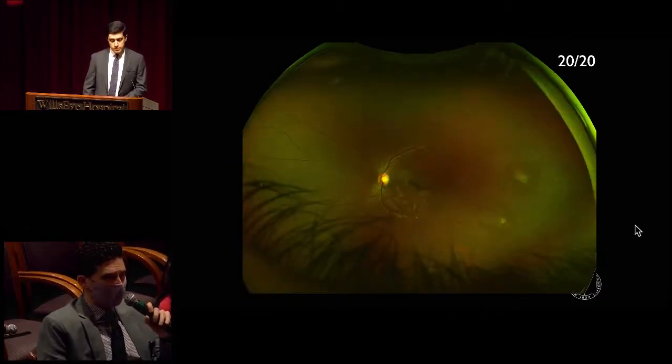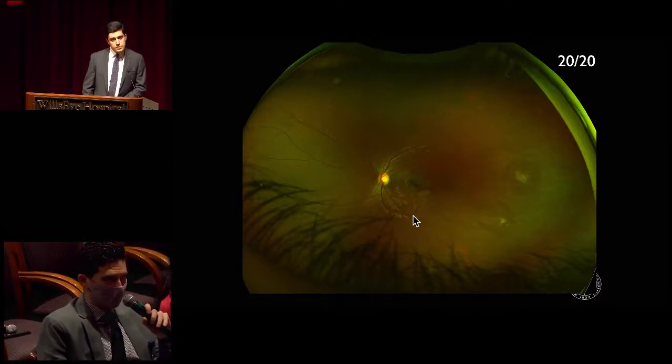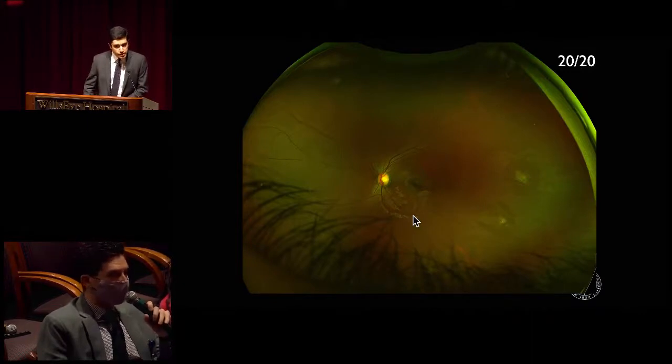And in the left eye, also 20/20, clear media without opacity. Sharp disc margins, again about a 0.5 cup to disc. Again, you can see this nice, healthy retinal nerve fiber layer sheen, which was also present in the right eye, and no lesions of the macula. The vessels, again, are normal course and caliber nasally and proximally, but again, possibly some attenuation out in the far temporal periphery. And again, there in the mid-periphery, there are these mixed hypo and hyperpigmented lesions, which you can see here. They appear to be deep. There looks like there's a vessel overlying this one. Looks like they have an equatorial distribution as well.